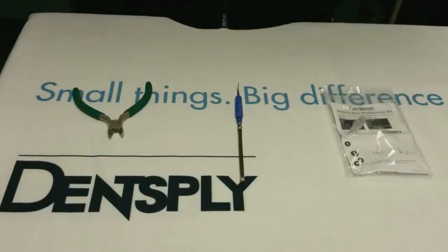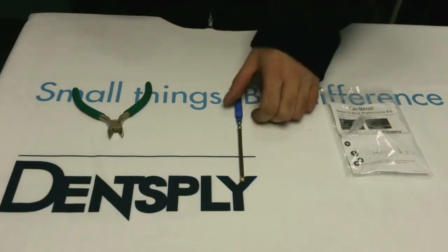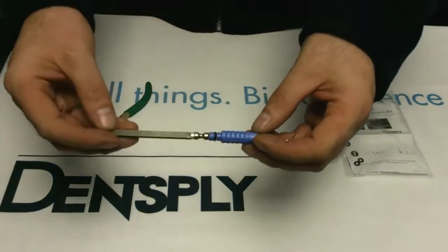Welcome to Dentsply Service Centre Tutorials. Today I'm going to show you how to replace the o-ring on the Cavitron insert.